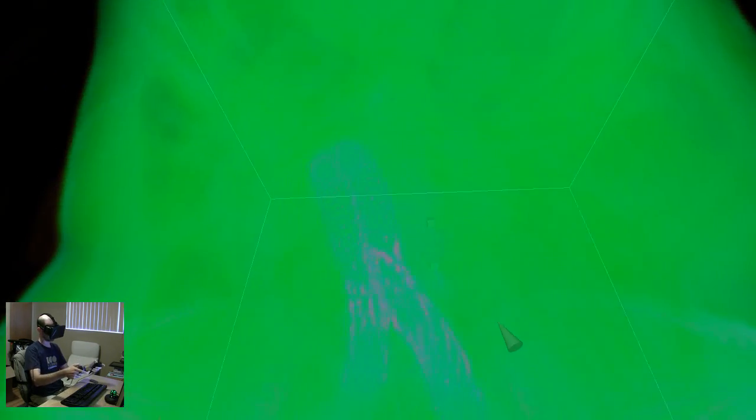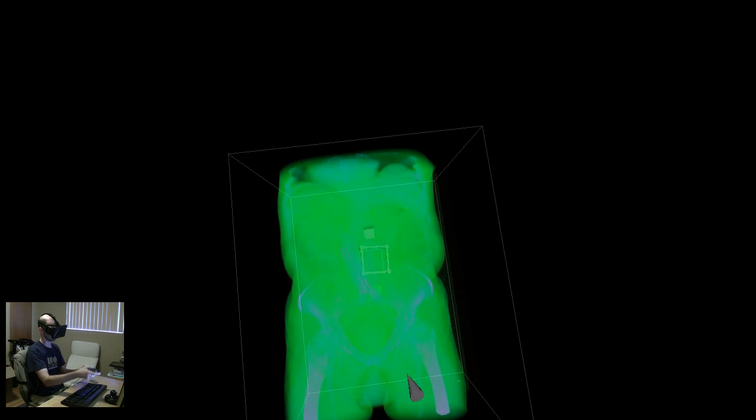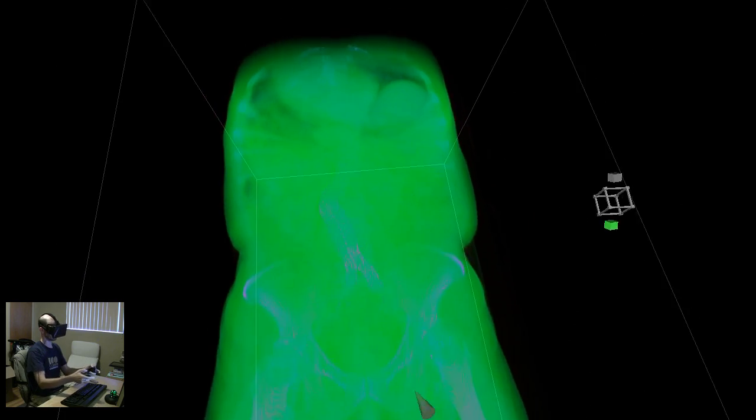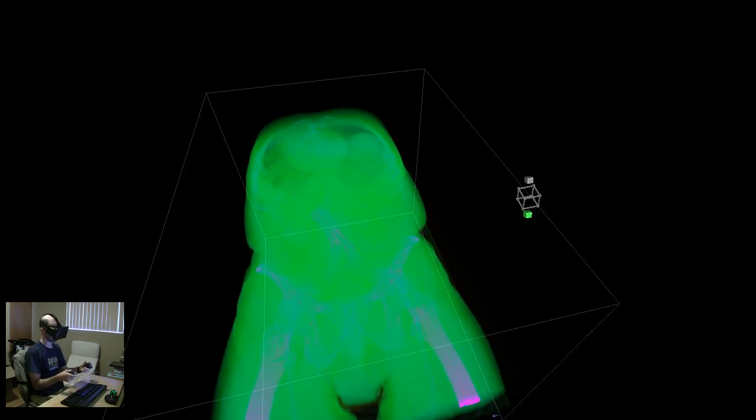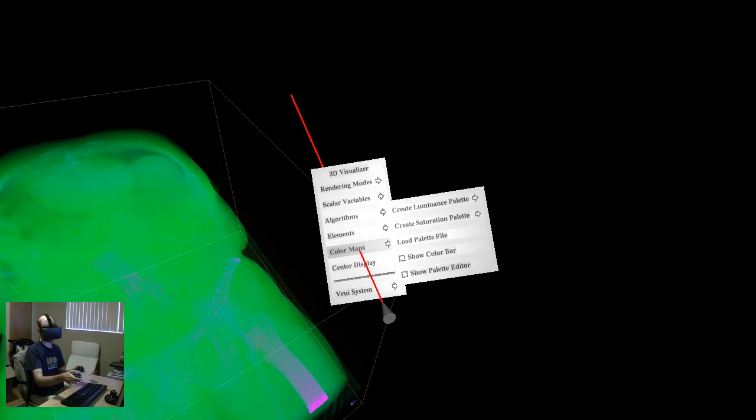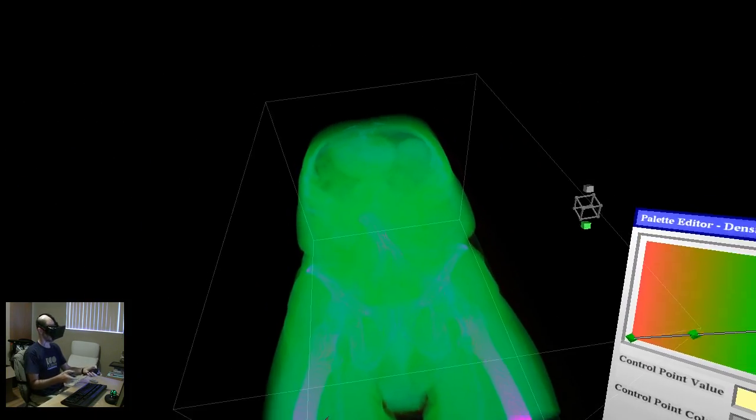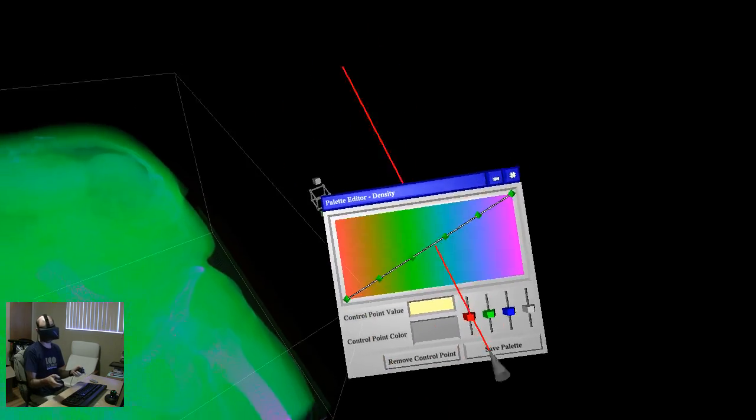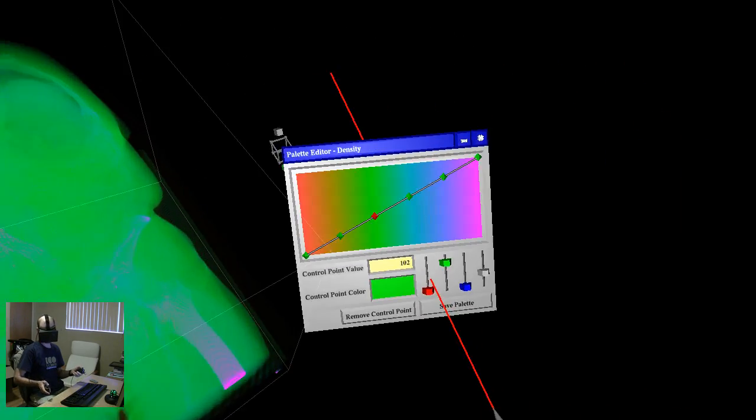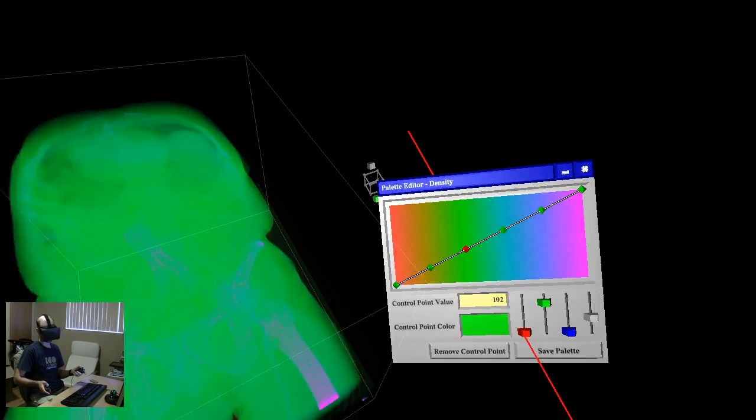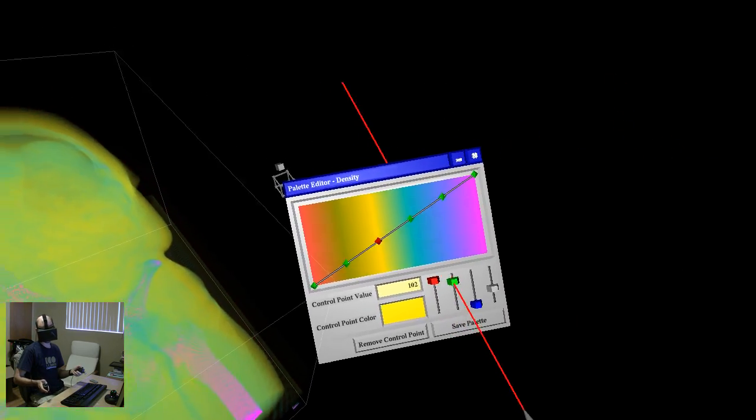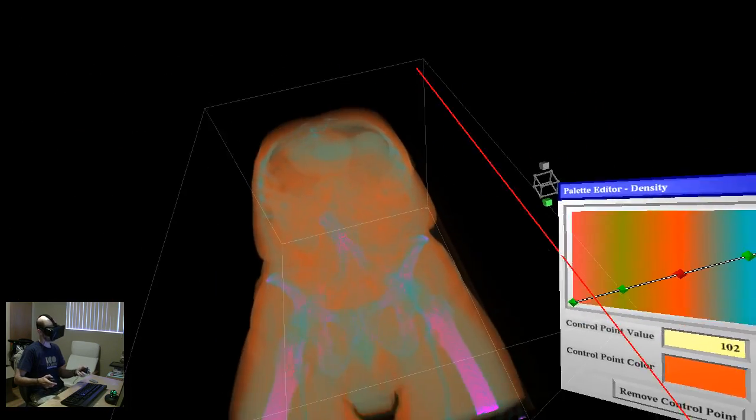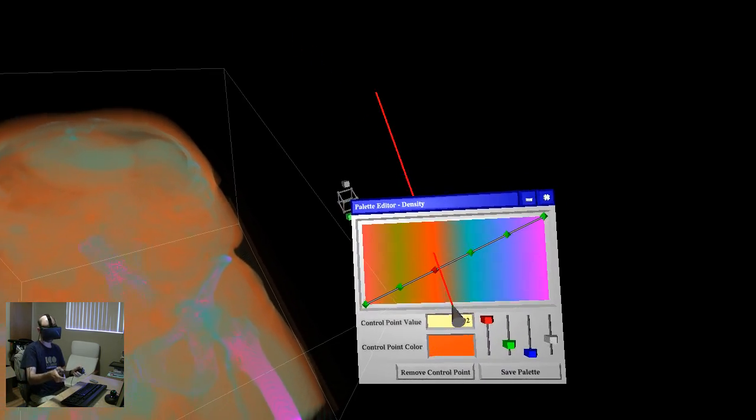I can put my head in there like this. And the nice thing about volume rendering is it reacts much more favorably to noise because it's an integral over ray direction. And also, it shows us a lot more things at the same time because it can interactively change the color mapping of data values to colors. This is this color palette editor where I can, for example, take the green stuff there and make it yellow. Or more importantly, I can change the opacity of this data value, which is here mapped up and down.